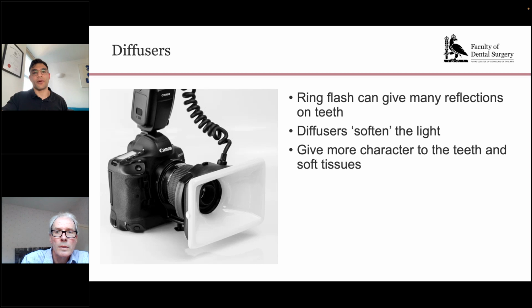Now, what's really interesting about this diffuser is that it's £60, made in Great Britain by some bloke in his shed. The equivalent American thing, which I do know the name of because it's actually quite a good name, is called the Flash Cap with a K. That's $500, and it does exactly the same thing as this, which was 60 quid. I think if you already take fantastic photographs, this has the potential to make them maybe 5% better. But the more important things are the composition and the exposure. I hope that helps.